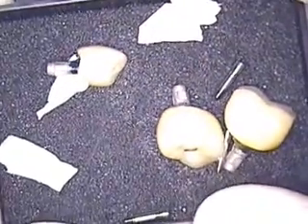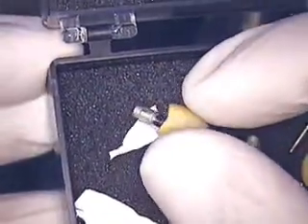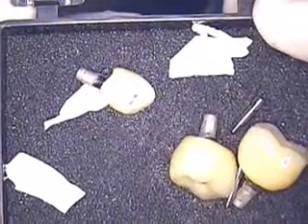One thing I want you to realize is that I already micro-etched the surface near where the composites are going to be placed. They're etched and silanated and ready to go.